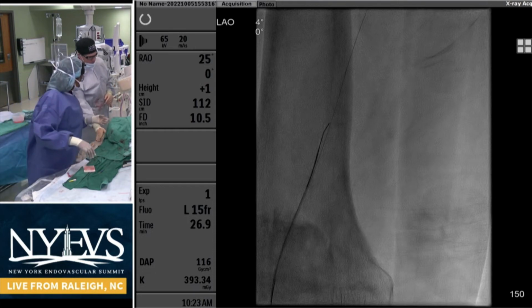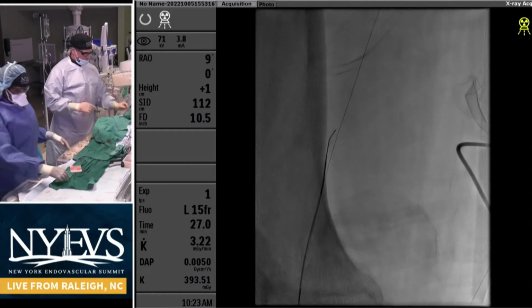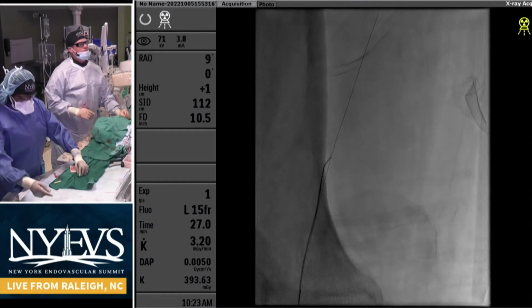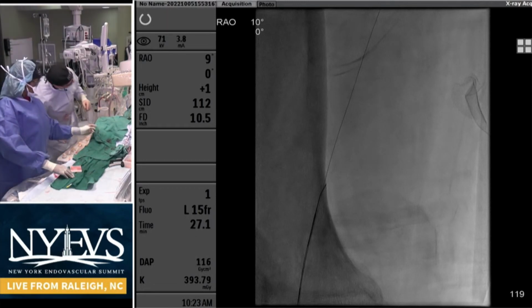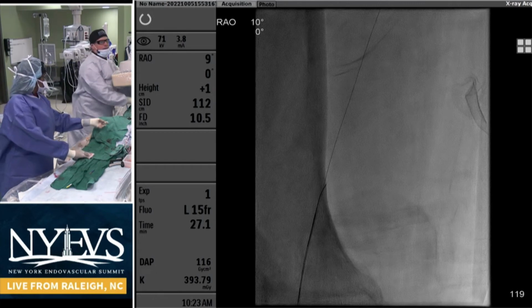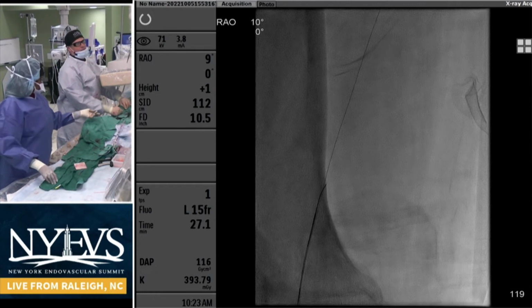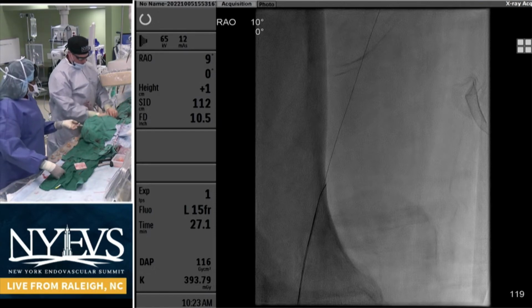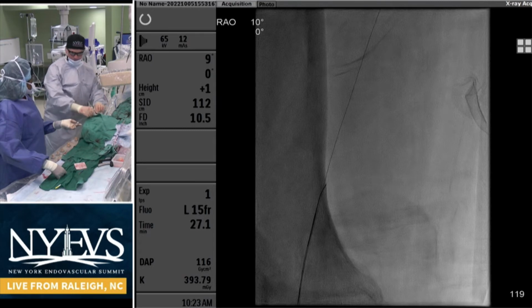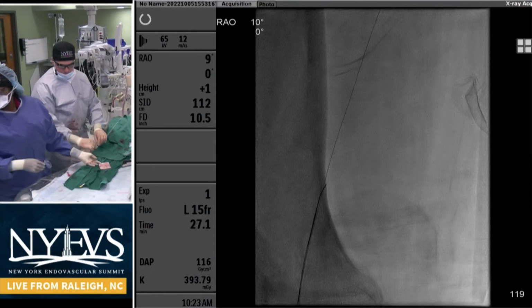Well, yeah, we'll go to the next talk, but just to get the panel on board. So any other different strategies, any other thought process from the panel? George, hello? Hey, George, this is Kumar. The only thing I like to do in these is I put a micro snare from below. Whether you have a decent access here from below, but I'll put a 4 millimeter snare because in that subintimal plane, right by the mid-patella where you saw them touch each other, that snare gives you a nice lumen to grab it without a catheter. And often I'll find that's what I would do here.